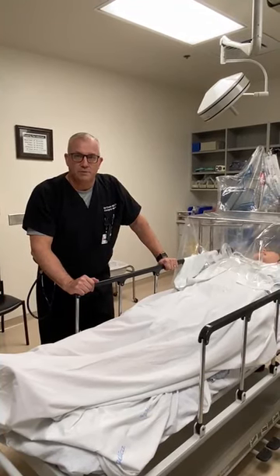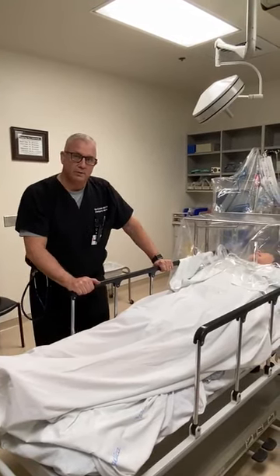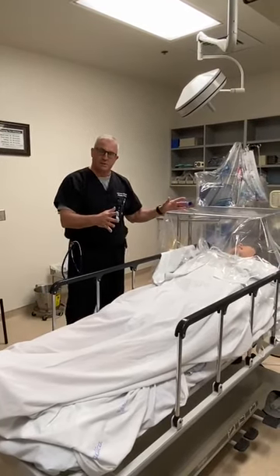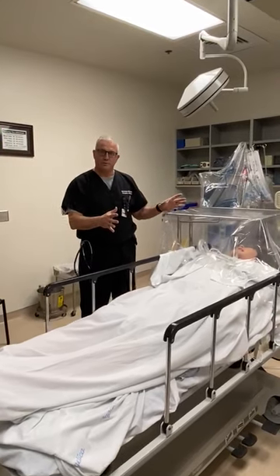Hi, Ken Kolarik with American Physician Partners. I'm at Cookville Regional Medical Center and I wanted to walk you through our procedure for tenting a suspected COVID patient for a rapid sequence intubation.